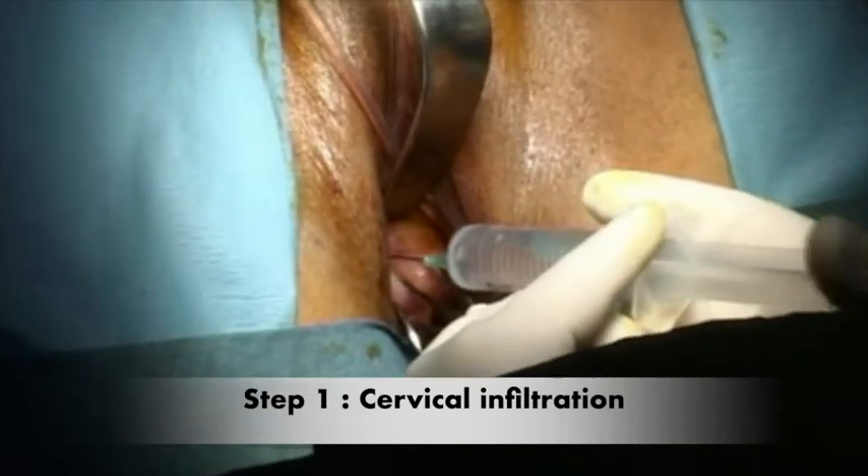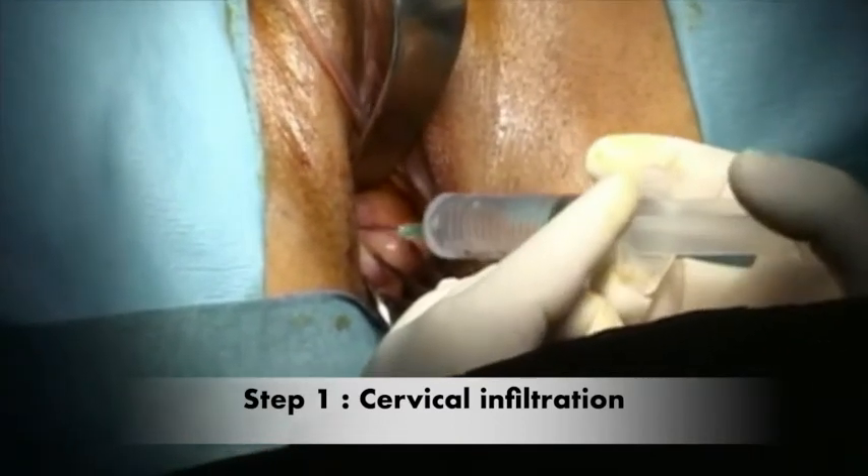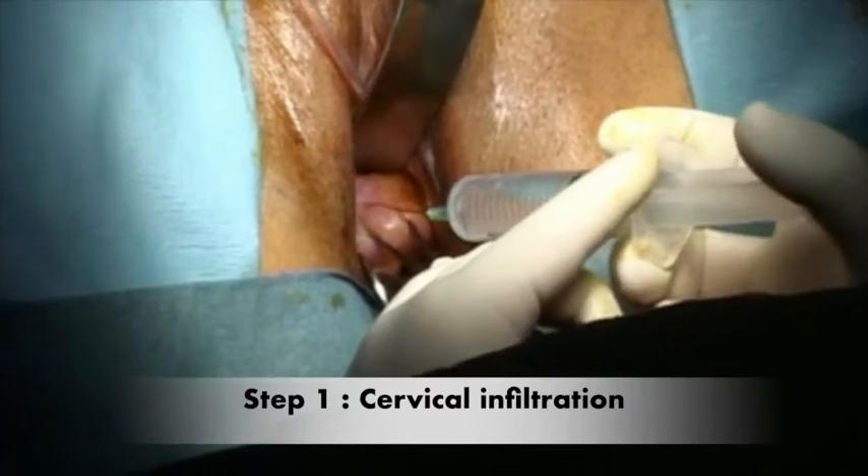We use Lidocaine 1% diluted in saline serum. 5ml is injected at the front and the back of the cervix.